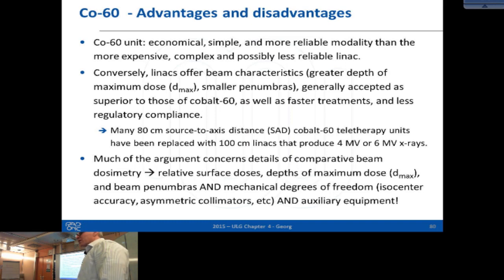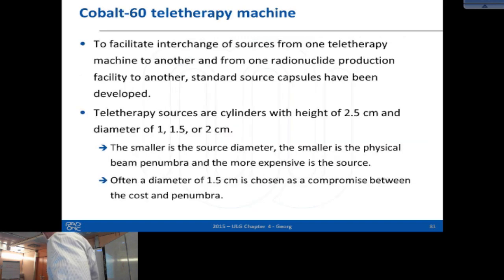These institutions have cobalt units, but without all this patient support stuff. And by the way, did you see our calibration cobalt unit? No. Okay, we can have a look at it next time.